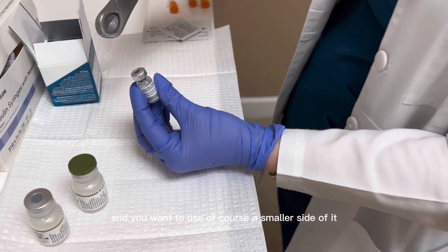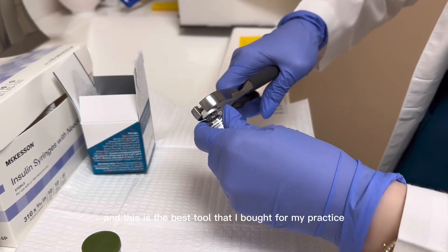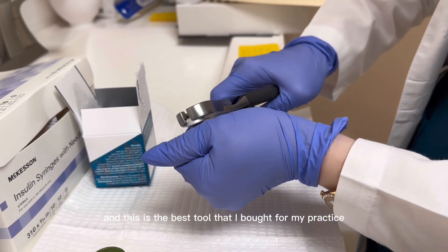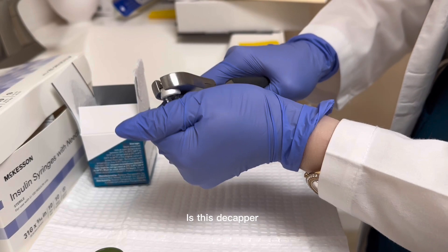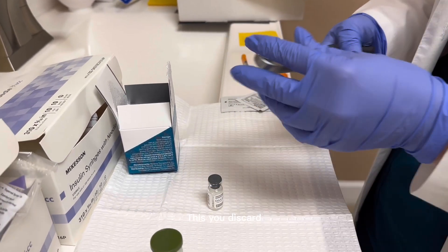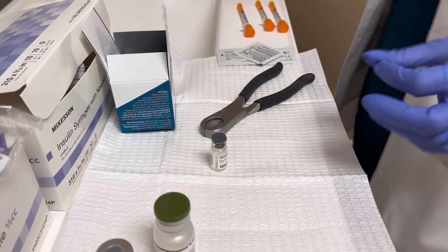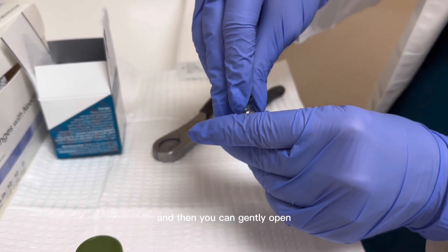Using the decapper, you want to use the smaller side of it. This is the best tool I bought for my practice — this decapper. You just decap it carefully so you keep the rubber on as you discard. Then you can gently open.